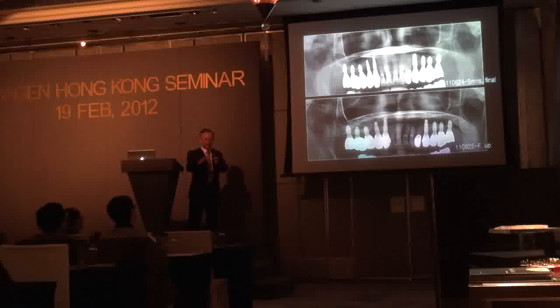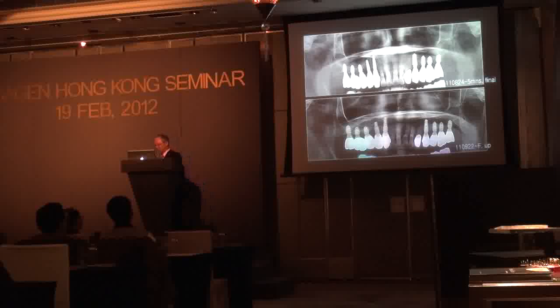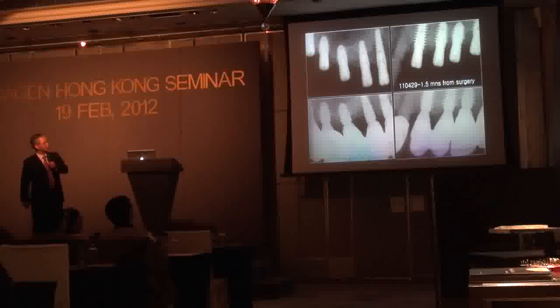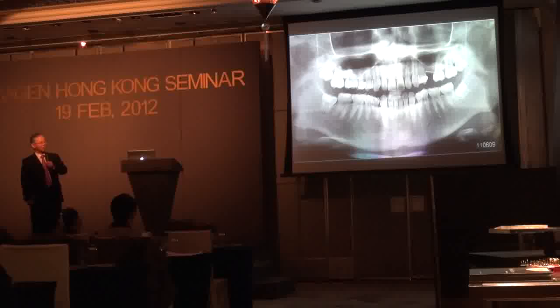Not for the long term, but patients feel very happy. And we did several cases, more than 10 cases now. Every case is a success, except one. I can show one more case. Let's look at this. So, yes, more bone is growing. It's forming on the sinus side. I can show one more case.